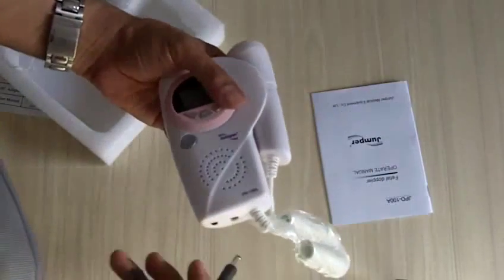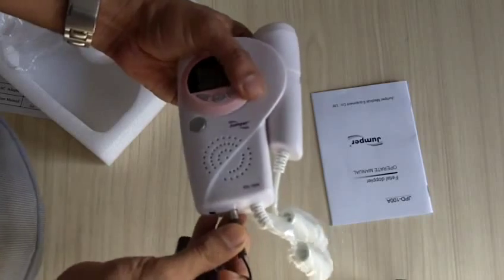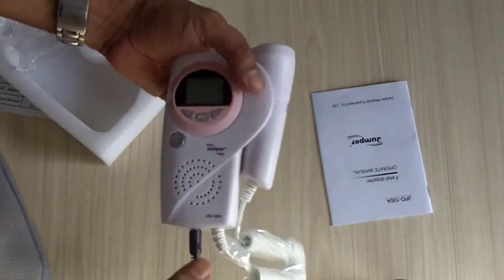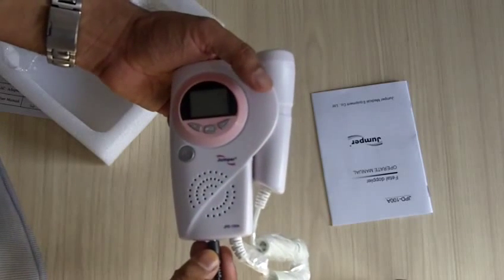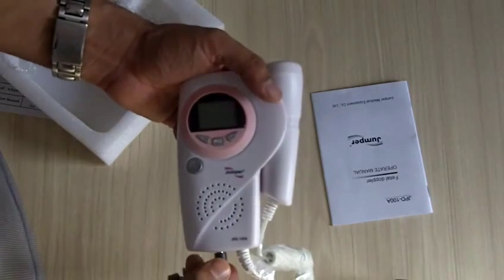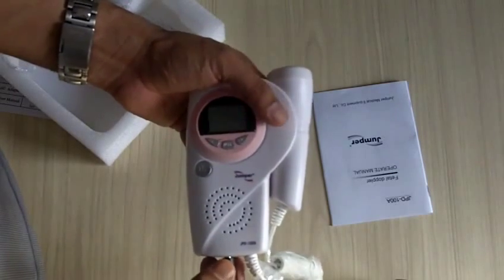This charger can be connected to the machine over here, and this will go to the mains plug. It's typically suggested that during your first three uses you should charge it completely for about eight hours, let it discharge, and subsequently you can charge it on a need basis.